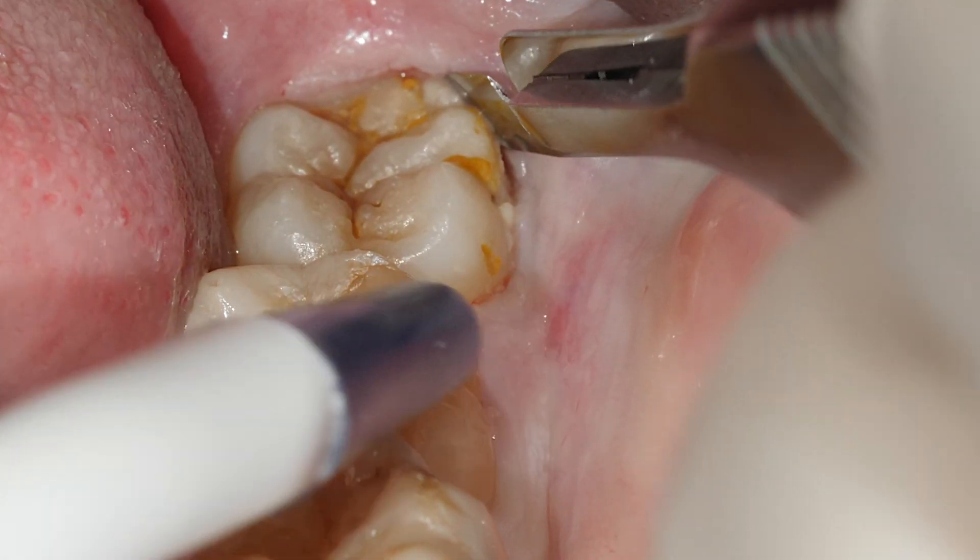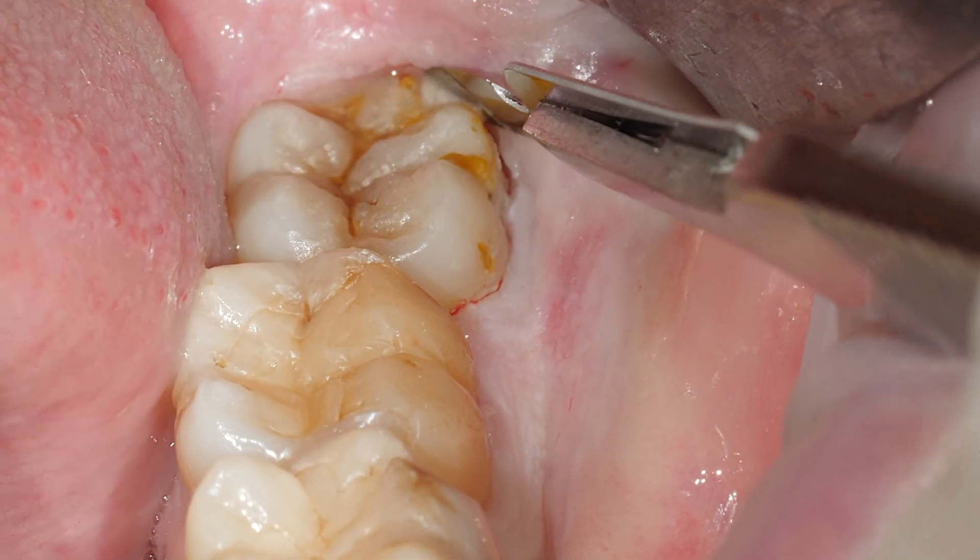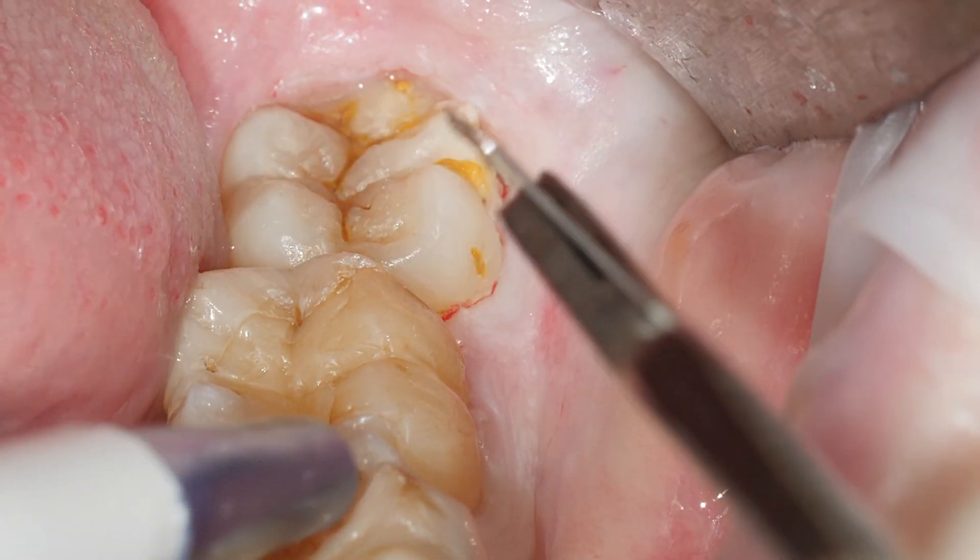Intrasulcular incision. Intrasulcular incision down to the bone.